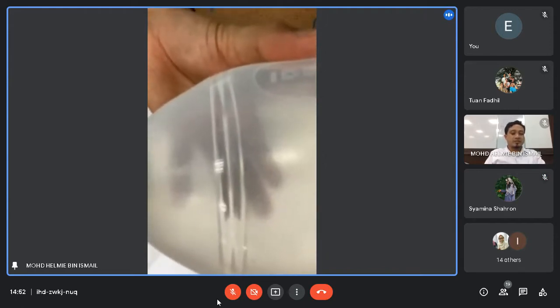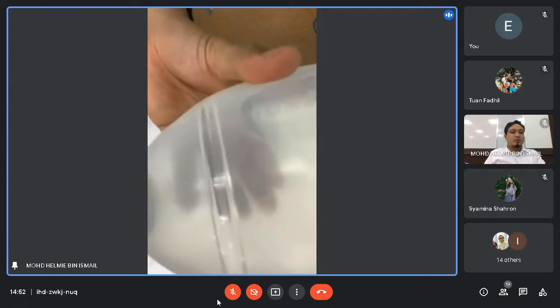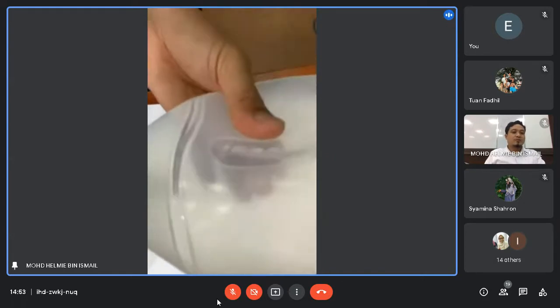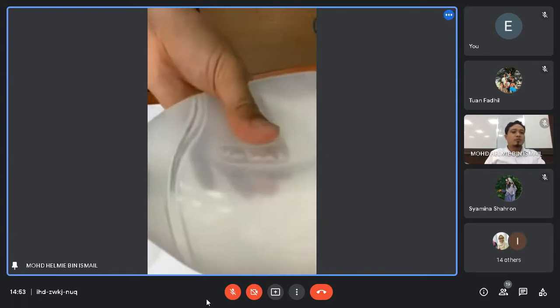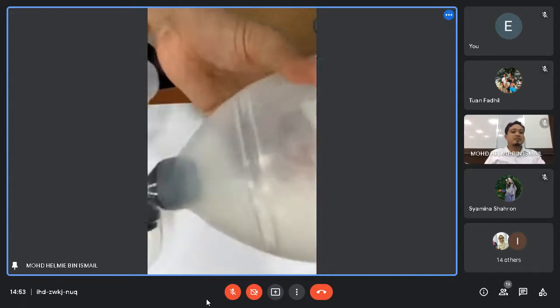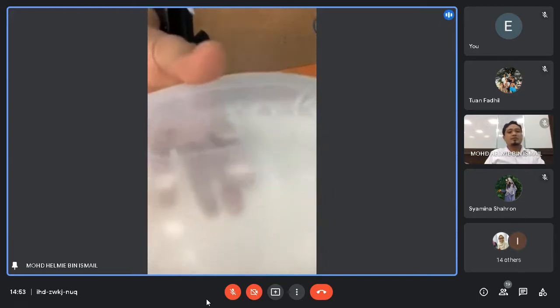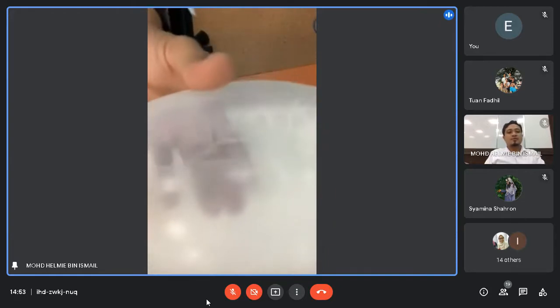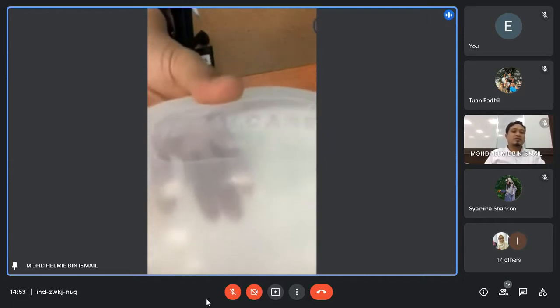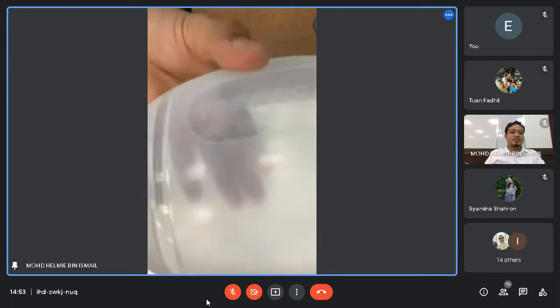Dia punya alveolus can rupture and then lead to pneumothorax because you give more tidal volume. The correct way is you need to give 1/3 from this volume. 1.5 liters you need to give like this. Alright. Okay, barotrauma, volume trauma, pneumothorax, you can boleh bagi tahu lah that is a complication of bag valve mask ventilation.